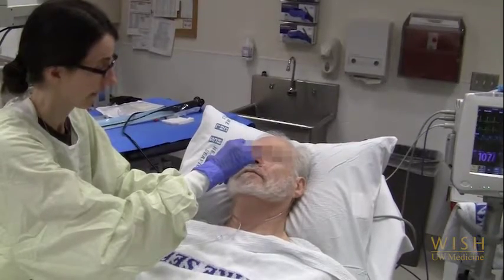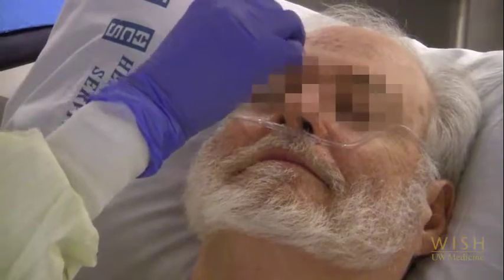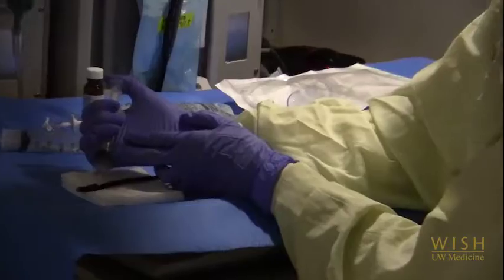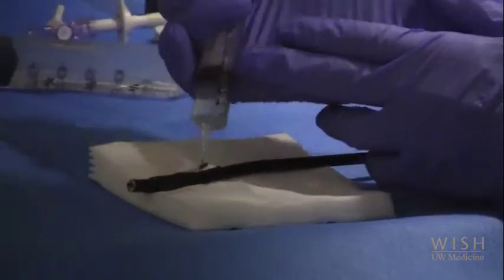Remember when inserting the cotton swabs that the nasal airway passage is perpendicular to the face. Gently insert the cotton swab until you feel resistance from the posterior wall of the nasal passage. A gentle twisting motion can help with insertion. More lidocaine will be applied to the airway through the bronchoscope during bronchoscopy as needed to control cough. Lidocaine jelly is applied to the end of the bronchoscope as a lubricant to aid passage through the upper airway. Be careful not to get the jelly on the bronchoscope lens.